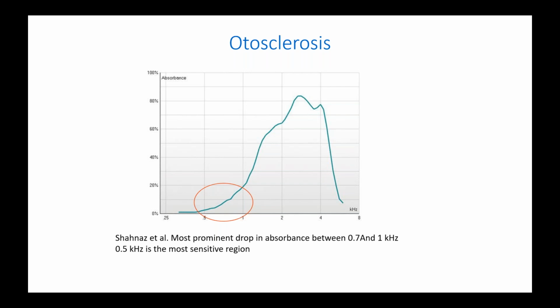Yeah, at this stage, another thing is we don't have objective criteria for all the different pathologies. For example, for otosclerosis, there are one or two studies that have identified objective criteria. For OME, they are starting to identify absorbance at different frequencies and the cutoff ranges. But we are still very far away from even saying whether it's a pathology based just on the objective results. So at this stage, it's a lot of subjective interpretation. So yeah, we're very far away from that, Madhuri. Yeah, I only understand the C1 and C2 which we used to do. None of the kids understand what is compensating for what. They don't know everything.